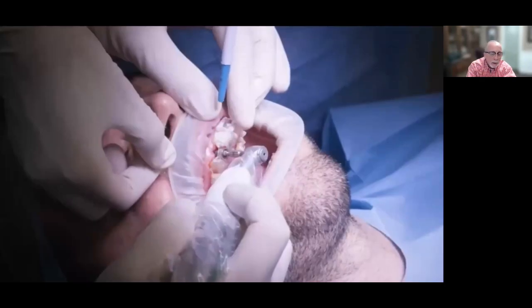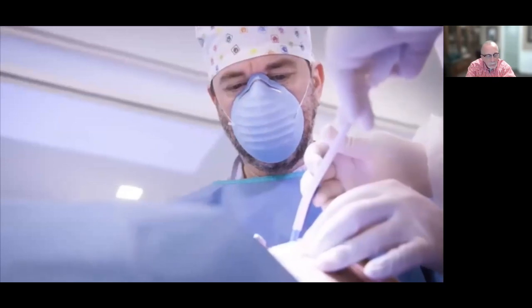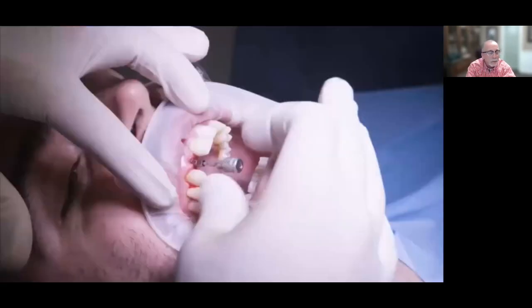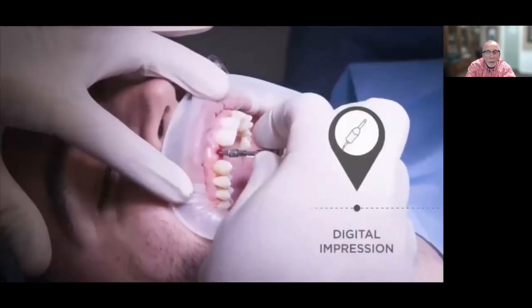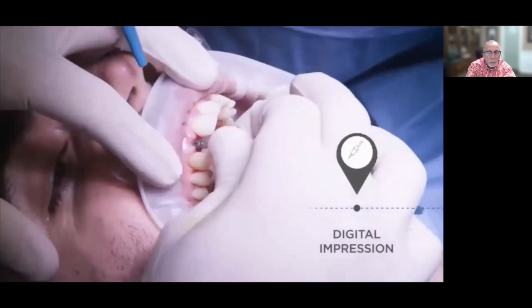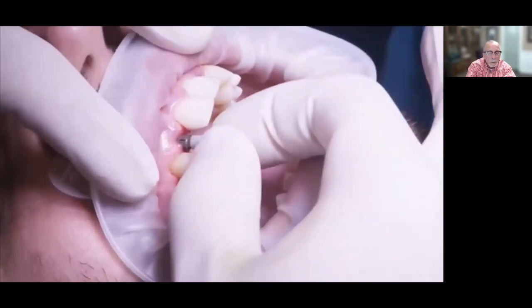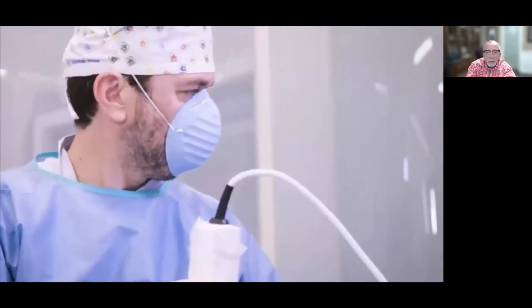Now, what you do after that is optional, right? We could cover that up and put a flipper or just let the patient heal. But sometimes the patient wants a tooth, and so we could make something temporary on top of that. But we can also take an impression and go ahead and get started on the final if we feel like the tissue's good. Ideally, though, you can let that tissue heal up. So we're going to do something temporary to get that tissue healed up. We've already been through that.